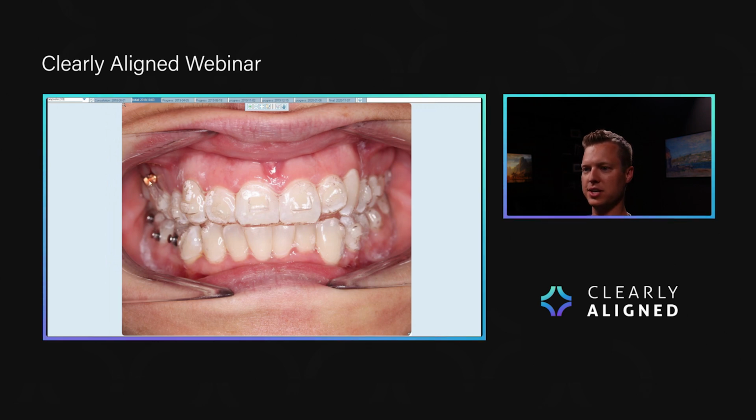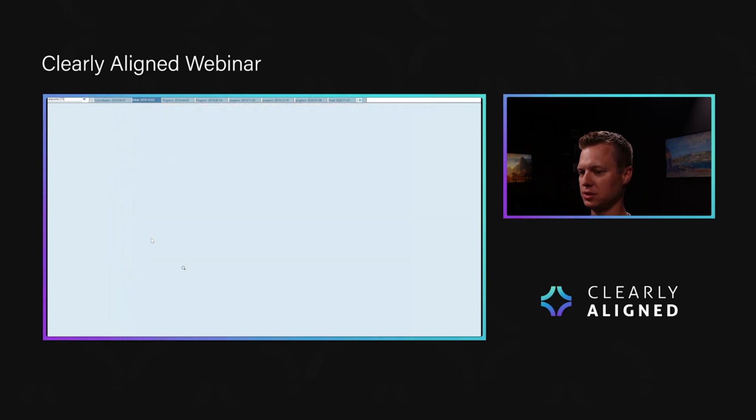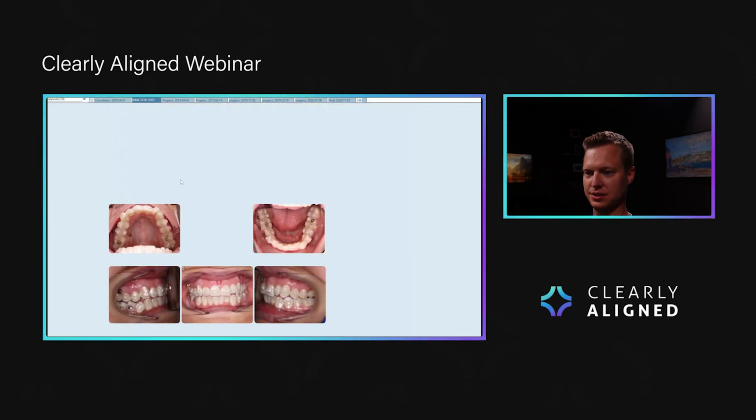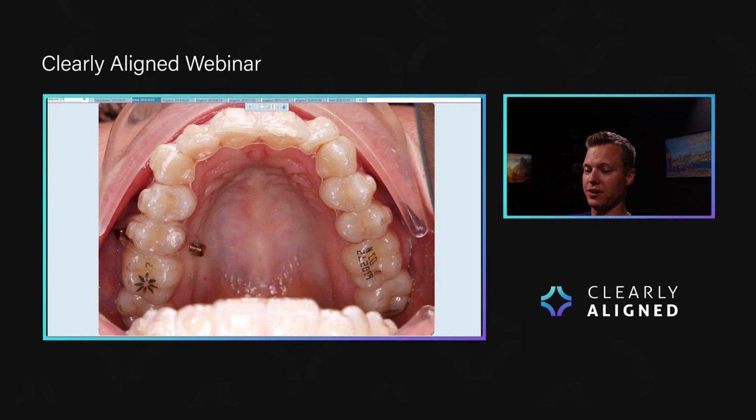What we're going to do is the patient's going to wear an elastic at nighttime, and the elastic's going to hook from their TAD down to those lower buttons to help extrude those teeth. So they're wearing their TAD on the upper all the time, 24 hours throughout the day. And then at nighttime, they're switching out and they're wearing an elastic from their lowers up to that upper TAD. So this is how we're hooking on the elastics for that patient. And so the elastic's what's actually doing all the work for us, right?